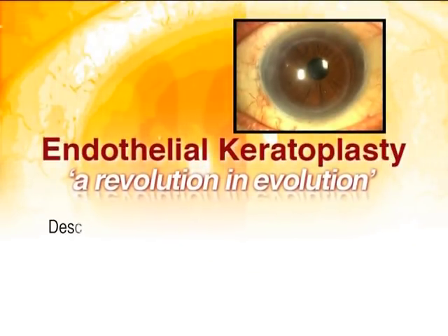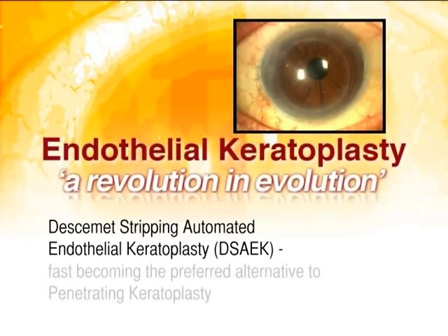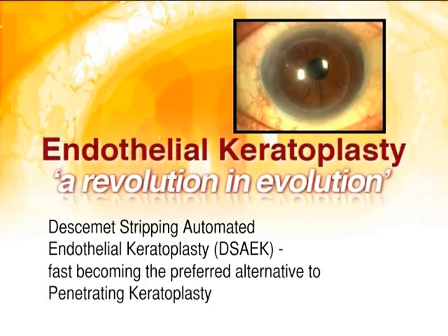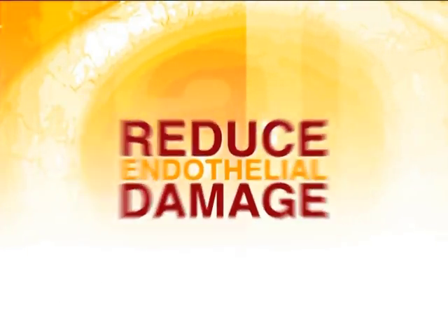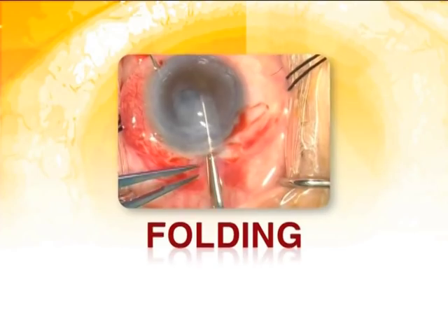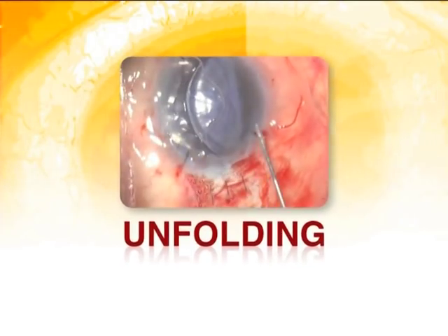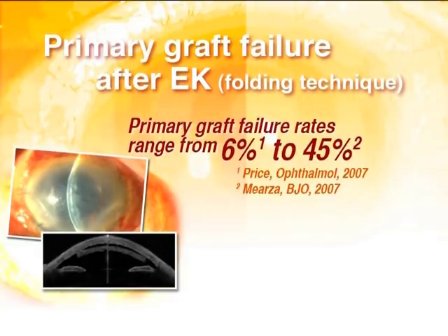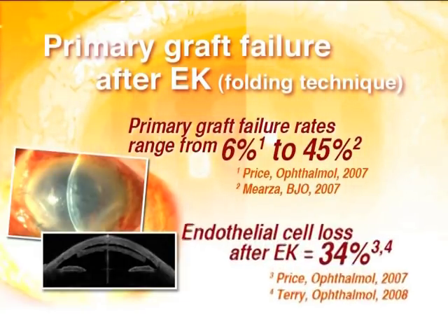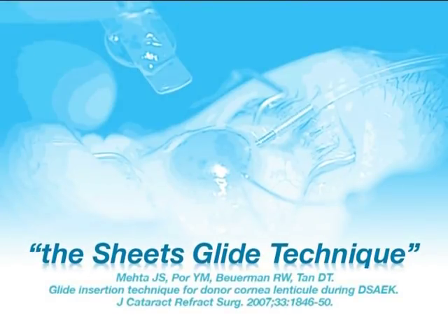Endothelial keratoplasty in the form of Descemet stripping automated endothelial keratoplasty, or DSAEK for short, is fast becoming the preferred alternative to conventional penetrating keratoplasty. But the major challenge is to reduce endothelial damage, largely induced by folding and unfolding the donor lamella in the AC, which can be surgically challenging. Recent studies report high primary graft failure rates ranging from 6 to 45%, and approximately 34% endothelial cell loss after surgery. As a result, surgeons are seeking alternative methods to implant the donor.